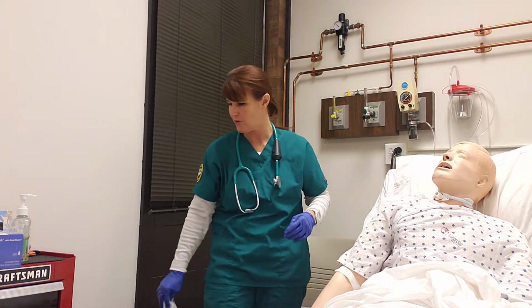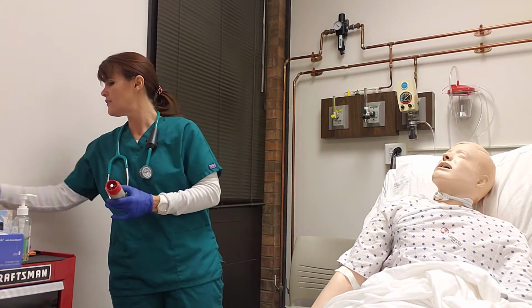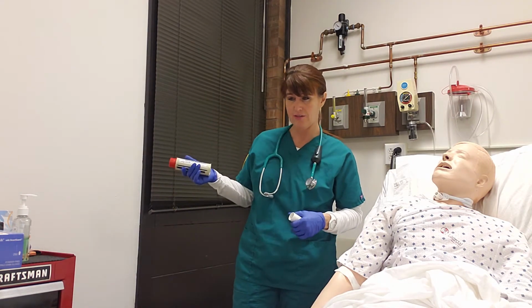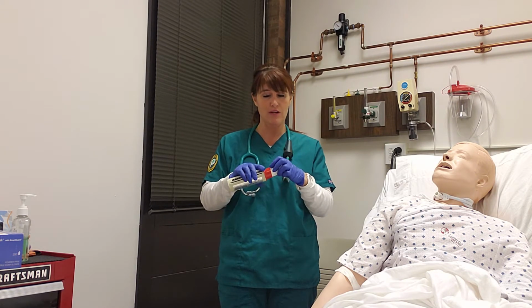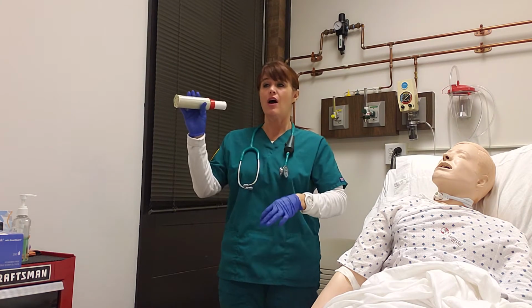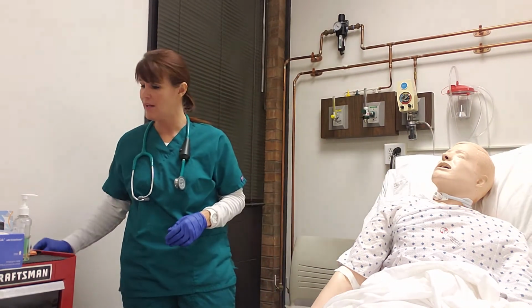All right, thank you. Okay, the next thing we're going to do is a peak flow test. Do you remember how to do that? This is the one where you breathe in a nice deep breath and then blow forcefully into this. Remember, we'll put this attachment on. Take a nice deep breath, wrap your lips around this, blow out. Okay, so after your patient does that, we are ready to move on to the medication.